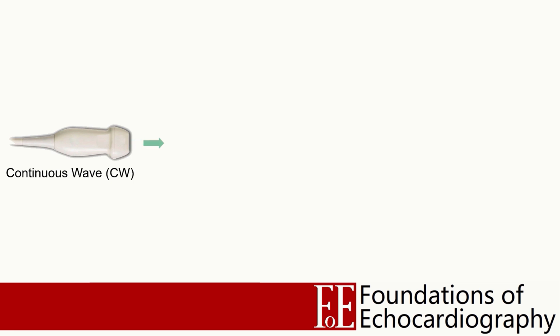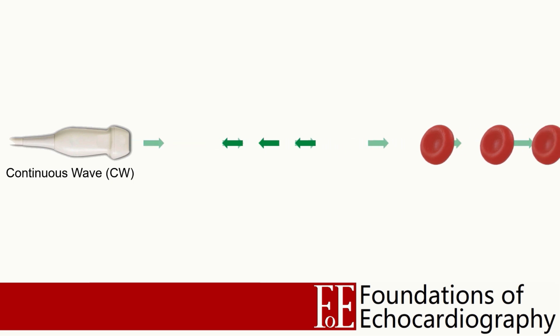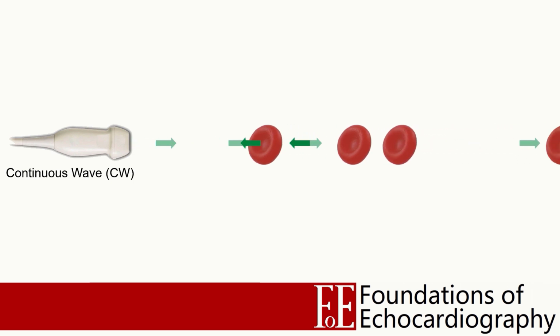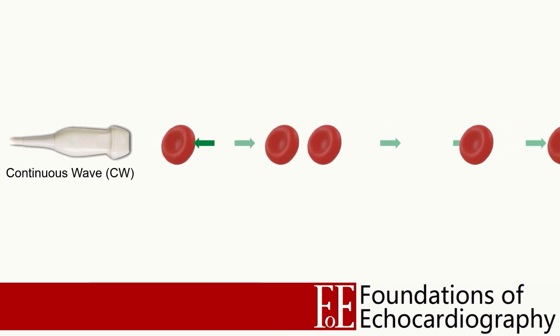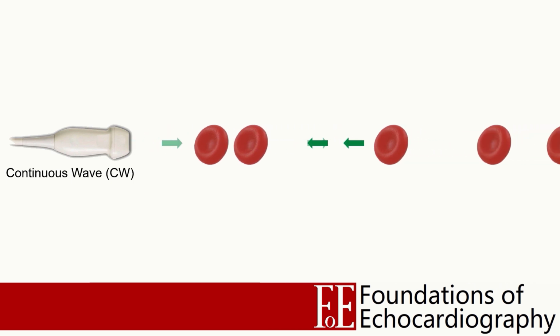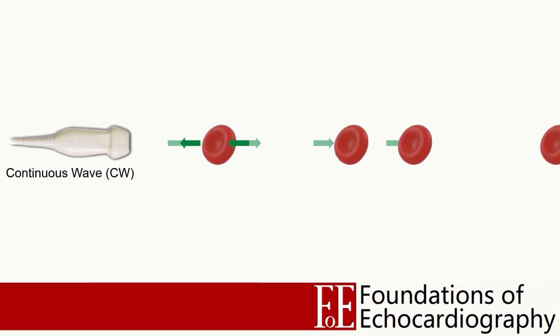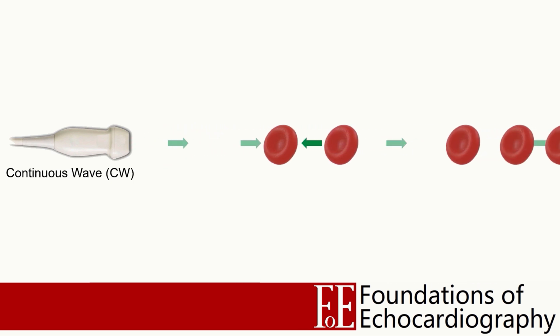The ultrasound wave passes into the body and encounters structures within the body as it travels. Some of these structures will be effectively motionless, whilst others will be moving. As we know from having studied basic ultrasound physics previously, the majority of the transmitted energy passes through the soft tissues it encounters. However, a small amount is reflected back towards the probe.